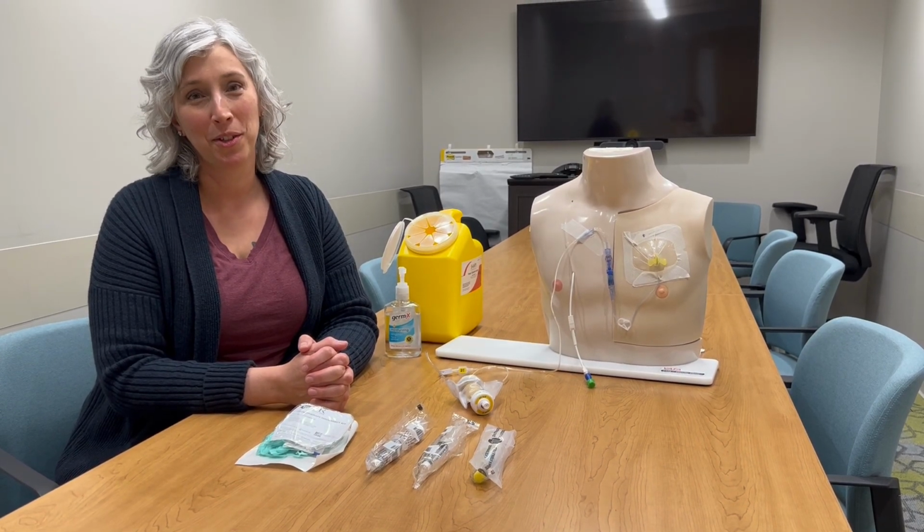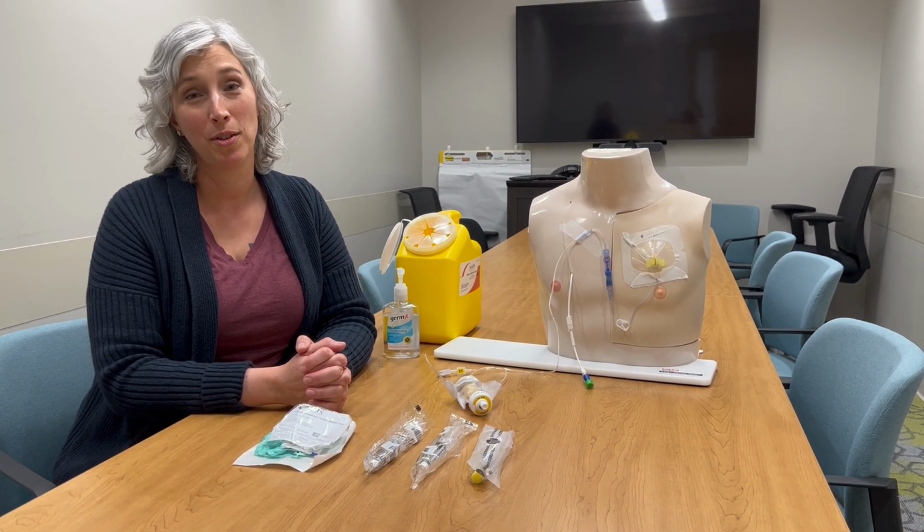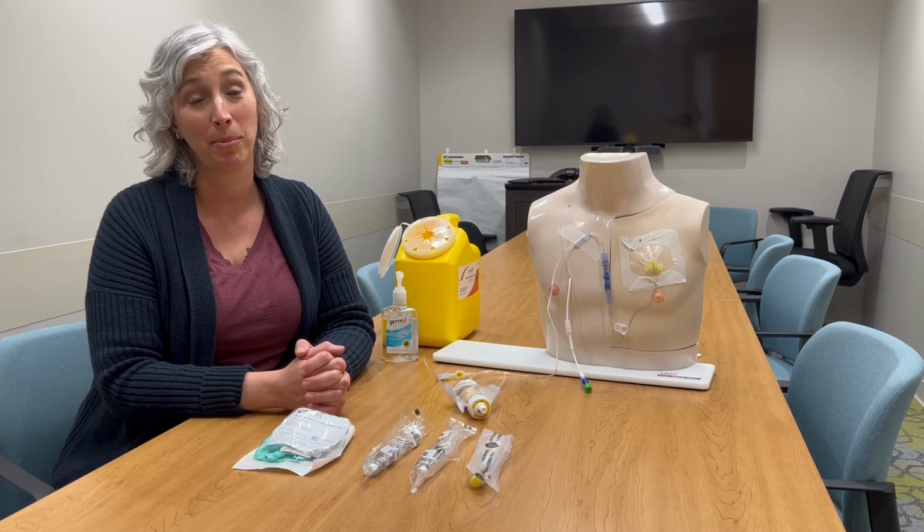Hi, I'm Kristen, one of the nurses with the Home Infusion Pharmacy, here today to show you how to disconnect your chemo when the infusion is complete.